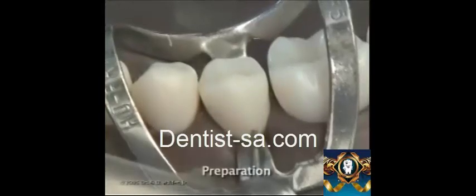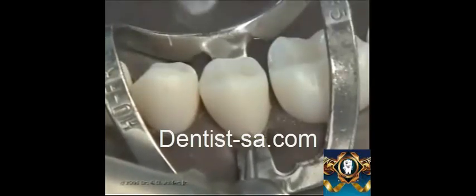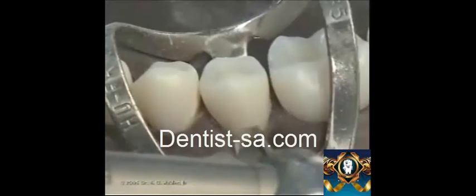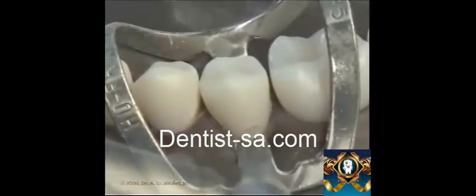The preparation is started using a straight fissure diamond. The cavity outline, form and shape are determined by the extent of the caries. The preparation is being done with a straight fissure diamond. Slowly it is being extended into the axial line angles of the tooth.